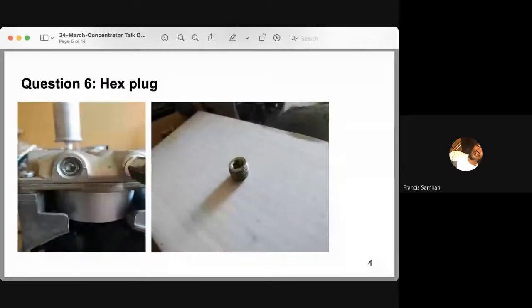Thank you, Maui. So oxygen concentrators use pressure swing adsorption techniques to provide concentrated oxygen. High pressure is required for the zeolite in the sieve beds to adsorb nitrogen from room air. This pressure is generated by the compressor by reducing the volume of the filtered air and delivering the air in a continuous stream. So the probable causes for the problem you are observing are worn-out service kits for the compressor, a restriction or a kink in the pipes, or leakages.